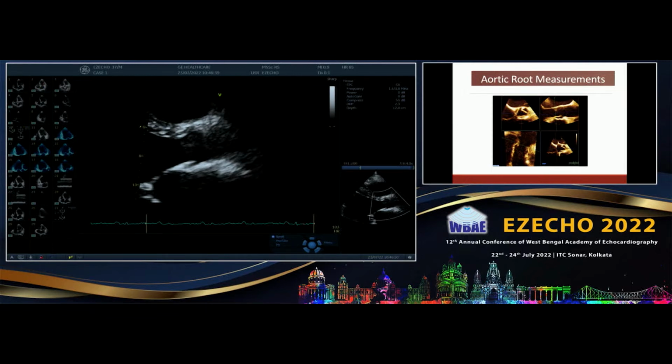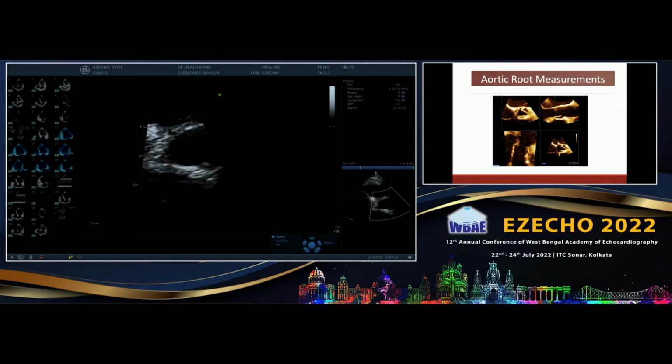Second thing is that this is your right coronary cusp. Now on this side, you should be in the commissure of the NCC and LCC. So in systole, this leaflet should slightly vanish, because there you will be in the commissure, while the RCC should be seen well. Otherwise, if you look at the short axis, you are slightly skewed, that is, you are going through the RCC, and somewhere the leaflet should vanish in systole. It should not look as beautiful as the RCC.